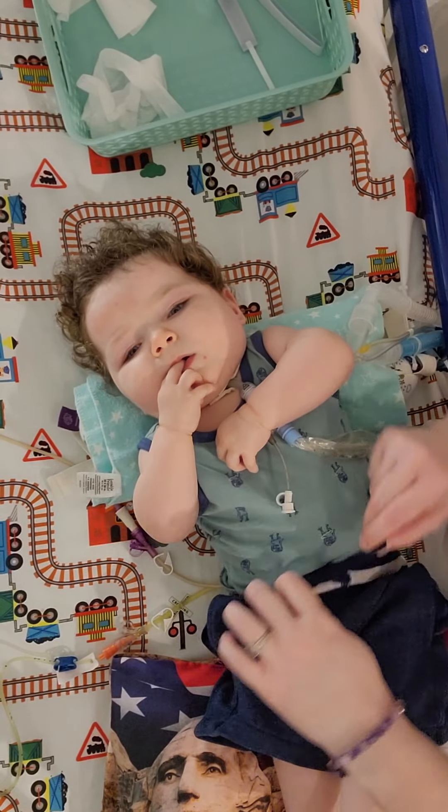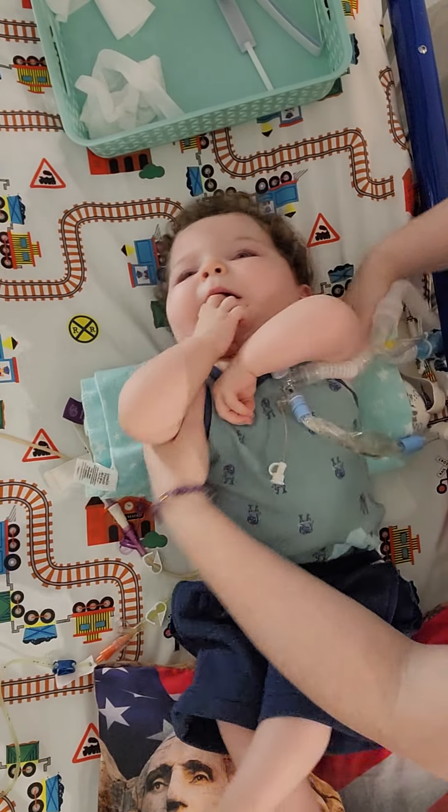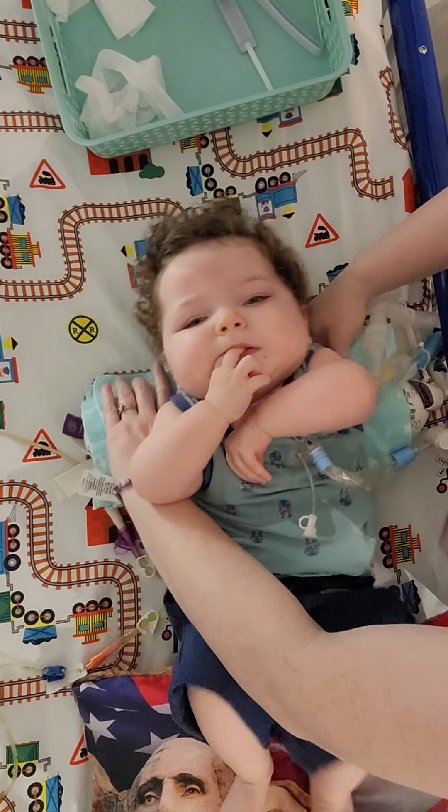We are going to do a solo trach tie change and James is going to try and not look at the camera.